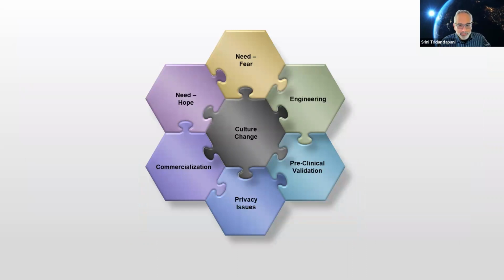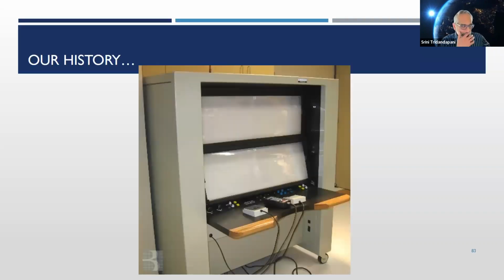So for all of this, you need to have a culture change. Anytime you introduce a new technology, anytime you put a new system into an existing environment, you're going to have to change the way people look and do things. And there's going to be some resistance. So in the past, we did radiology with films. We used to hang films on these view boxes, basically light boxes. We would look at the radiographs, the printed film.